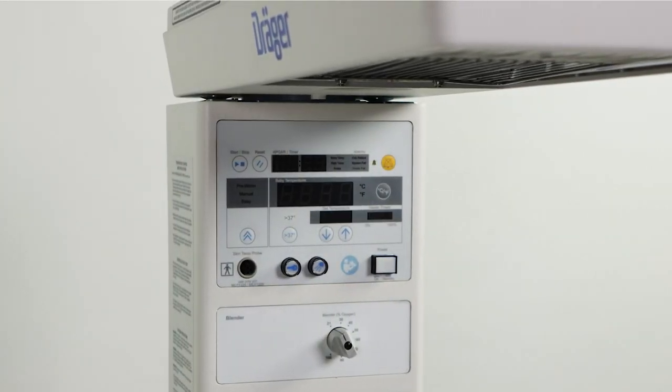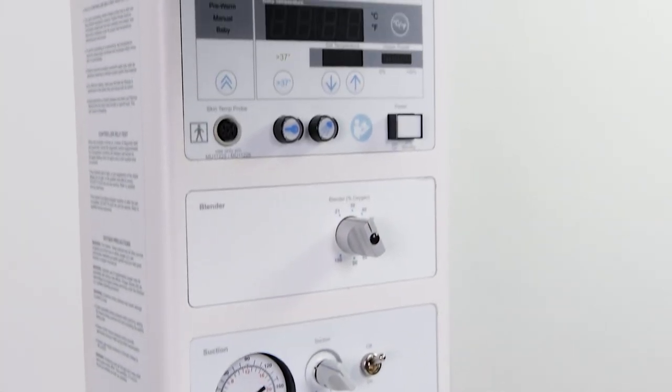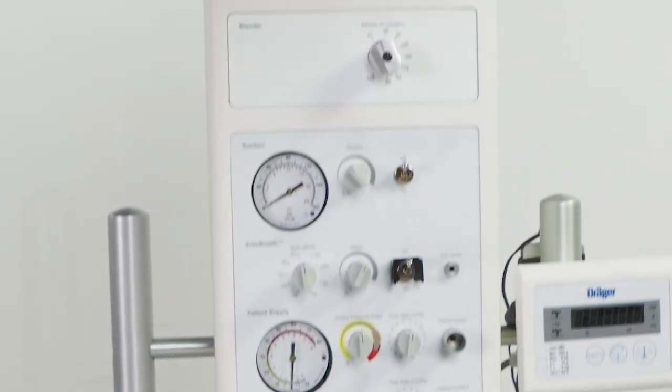In the following part, we would like to demonstrate how to use the Resuscitaire device. The device will be demonstrated using four features: thermoregulation, developmental care, ease of use, and infection prevention.